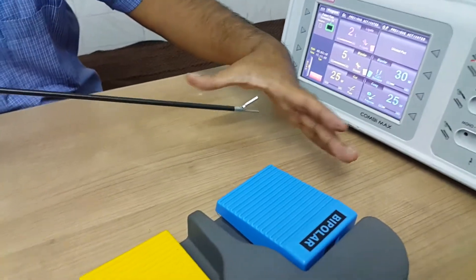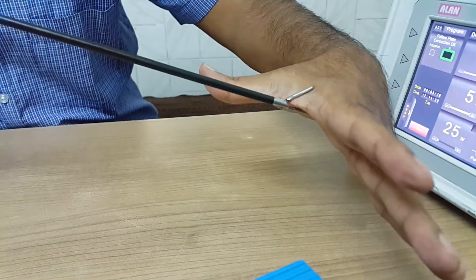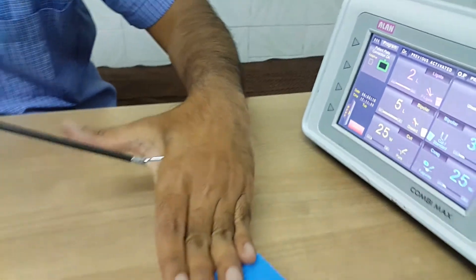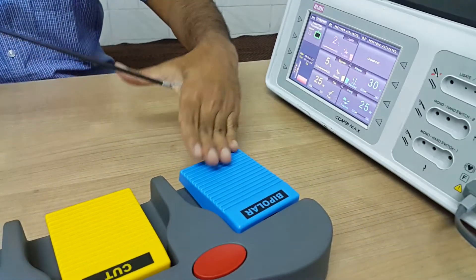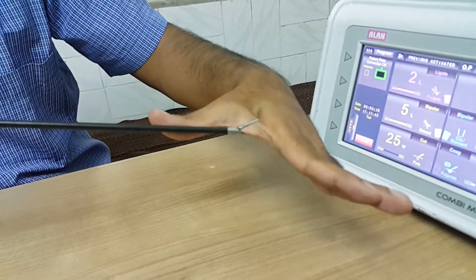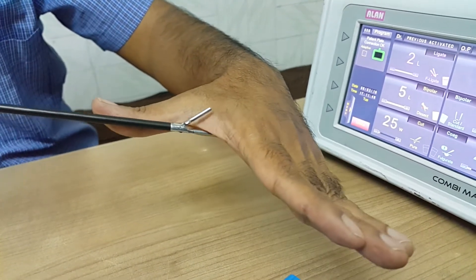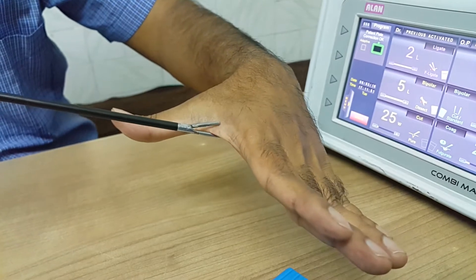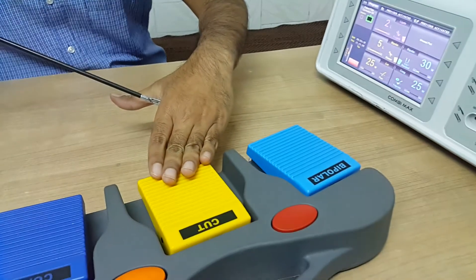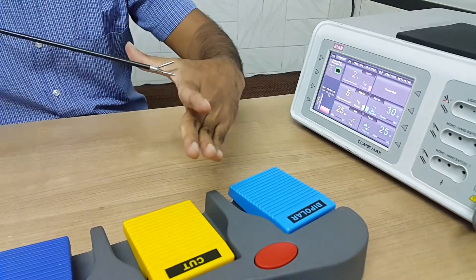Now, suppose I want to seal a part — you have to grasp the complete area with the jaws, then press the ligate switch. Once the vessel is sealed, the machine will give you an alarm. Then simply remove it and grasp a smaller area — not the complete area — grasp just a little area and press the dissect mode at the same place where you have ligated. The moment you press dissect mode, it will immediately cut.